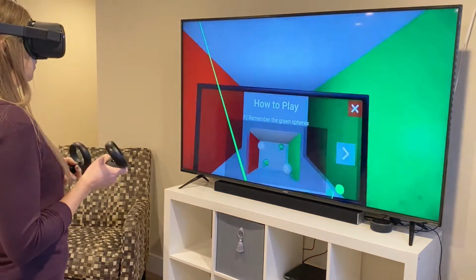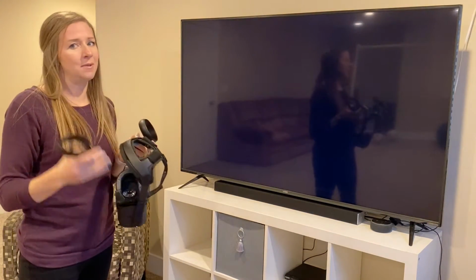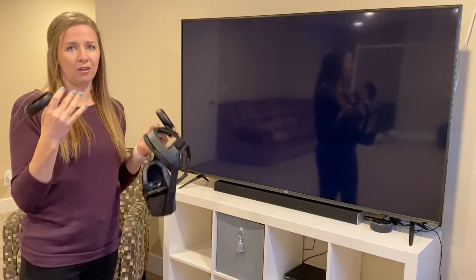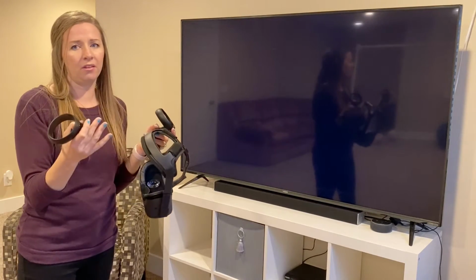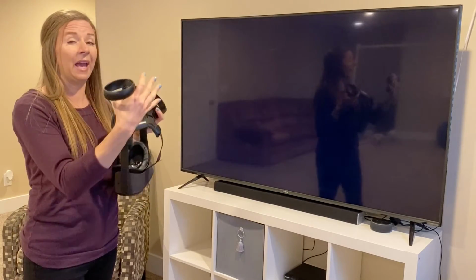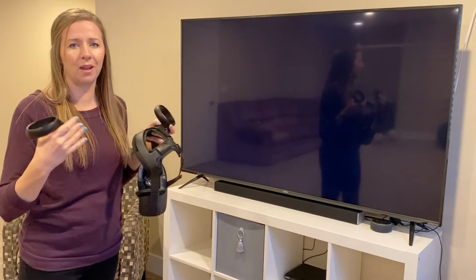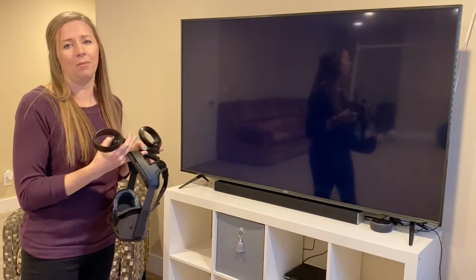I really love this one as well. And you might notice, I might not love these games based on how they were meant to be played, but for me, as someone with strabismus who's trying to learn to use their eyes together and see depth, I'm looking at other things besides just how the game is meant to be played. I'm looking at, like, can I picture space between objects, and can I interact with my environment in a way that makes that easier? So that's the kind of stuff that I'm looking at when I'm comparing differences.